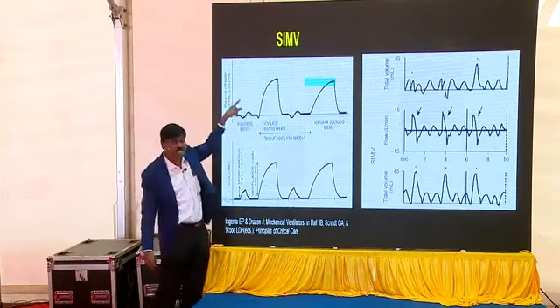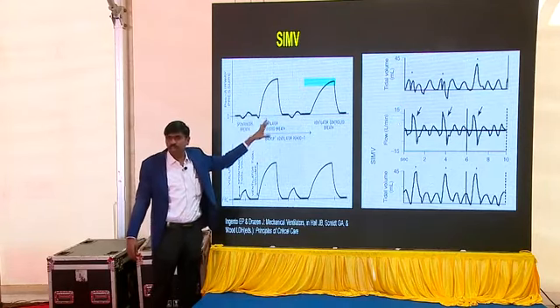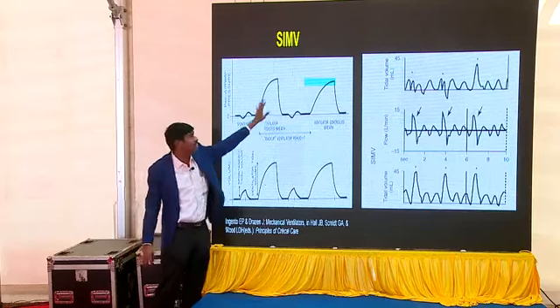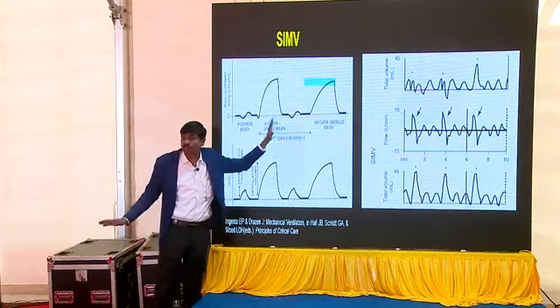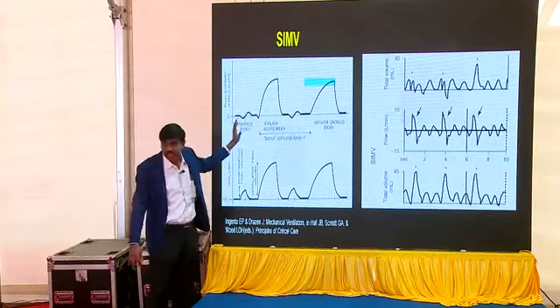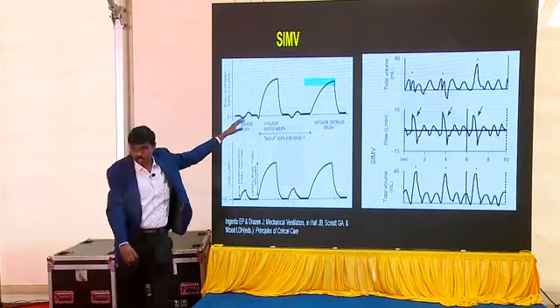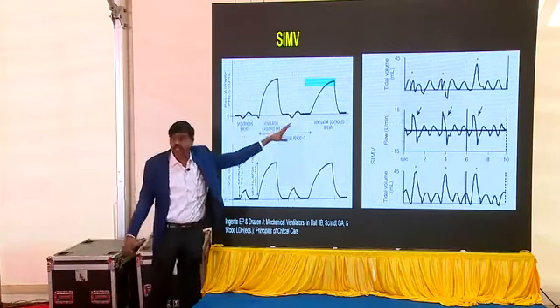Now how do I say this is a baby's breath? If you see this kind of a graph, how do you say this is a breath that has no baby effort? It's just the machine which is driving in. Very good. So whenever you see this negative deflection, it means that the baby has initiated a breath and then the machine has, so that's called an assisted breath. That's called a controlled breath.